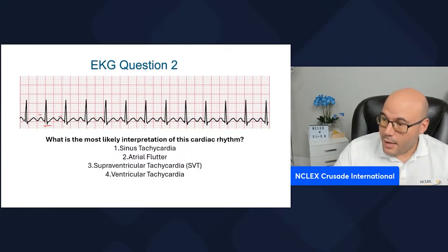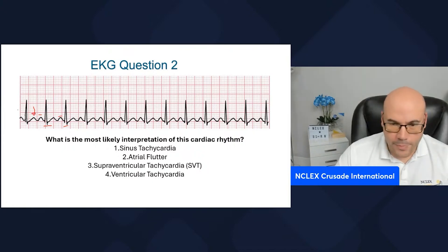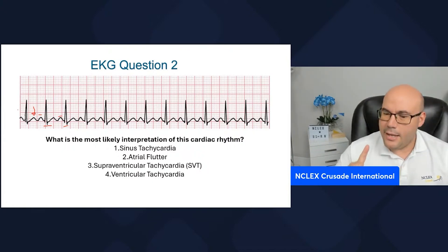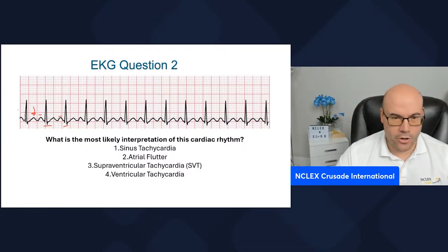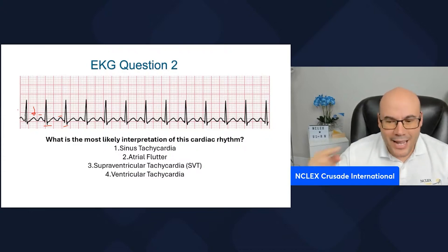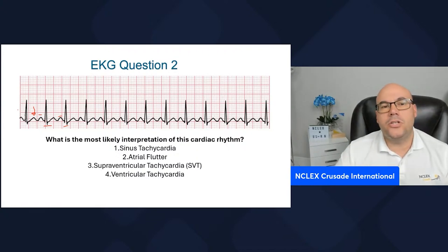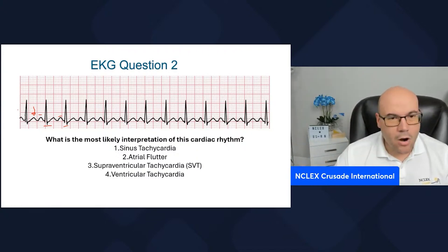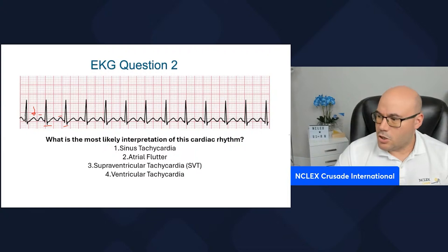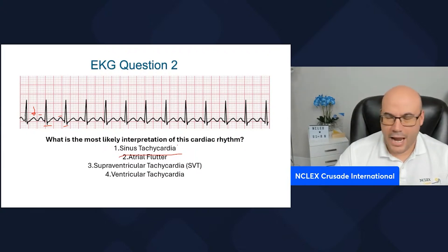We have one P and one QRS. Because this one here that you're looking at — this is the T wave, not another P. The reason I'm saying this is because I noticed some of you analyzed this as atrial flutter. Remember that in both atrial flutter and atrial fibrillation, the confirmation is that you need to see multiple P waves. There are no multiple P waves here — only one P wave and a QRS complex. So this cannot be atrial flutter.